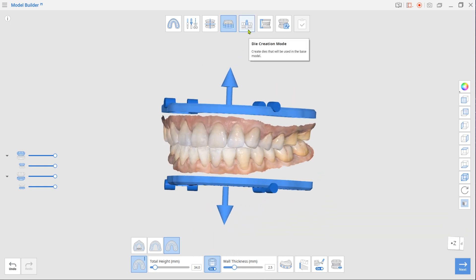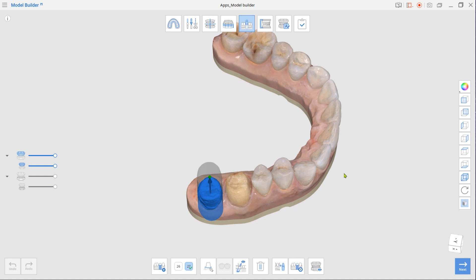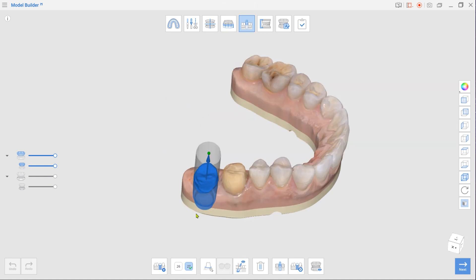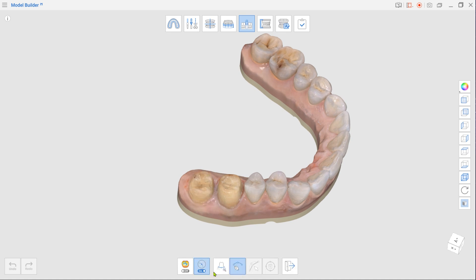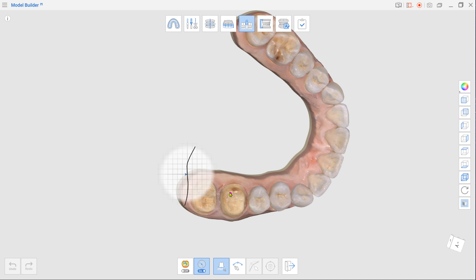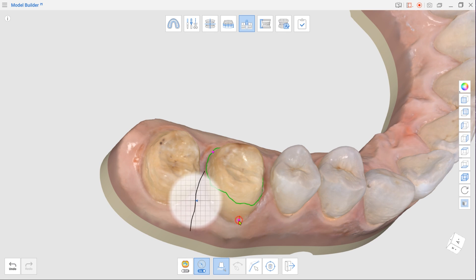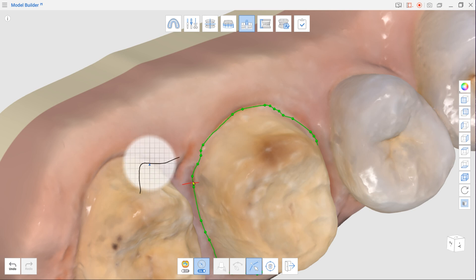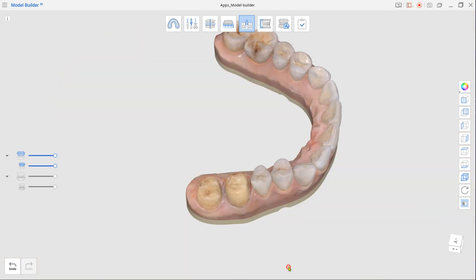When done, move to Die Creation mode. If you drew margins for the prepped teeth in Medit Scan for Clinics, your dies would be created automatically. If there are no imported margins, first select a tooth number in the toolbox and click Margin Line. Then, in the Margin Line toolbox, select Auto Creation. Zoom in on the prepped tooth and select a few points on the data. Use the Edit tool to correct the automatically created margin. Exit when you are done and repeat the process for other teeth.